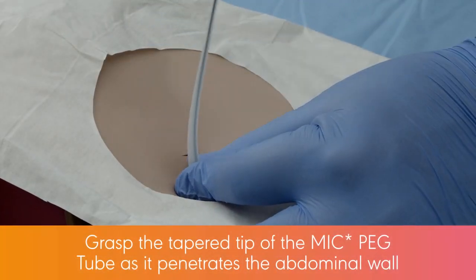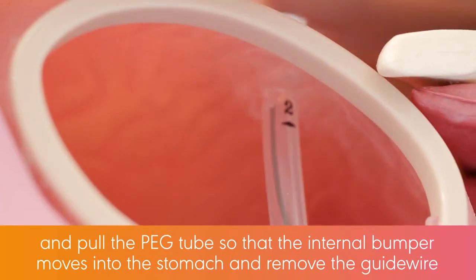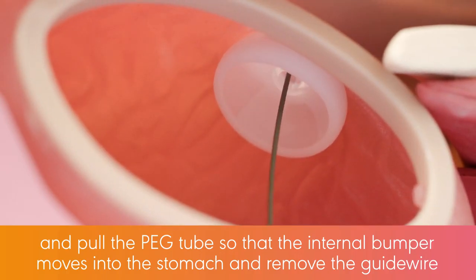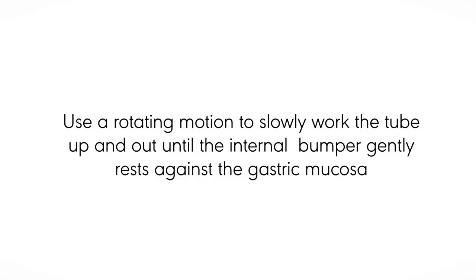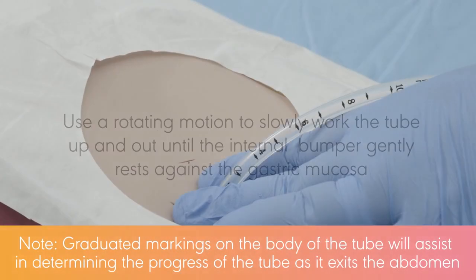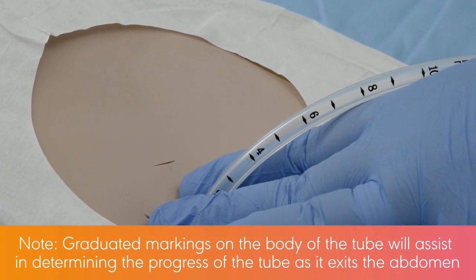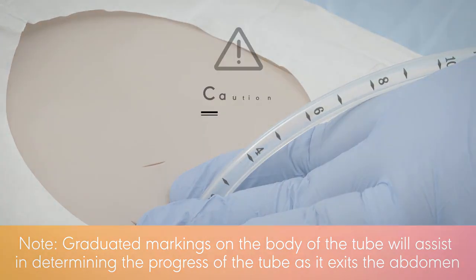Grasp the tapered tip of the MIC-PEG tube as it penetrates the abdominal wall and pull the PEG tube so that the internal bumper moves into the stomach and remove the guide wire. Use a rotating motion to slowly work the tube up and out until the internal bumper gently rests against the gastric mucosa. Note: graduated markings on the body of the tube will assist in determining the progress of the tube as it exits the abdomen.